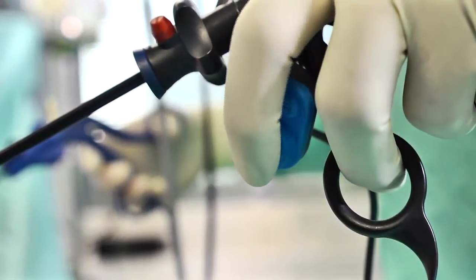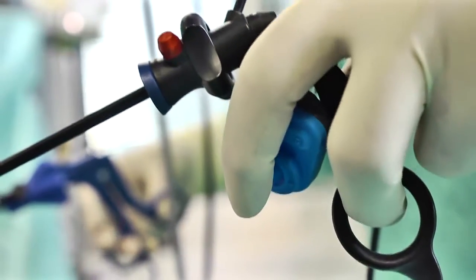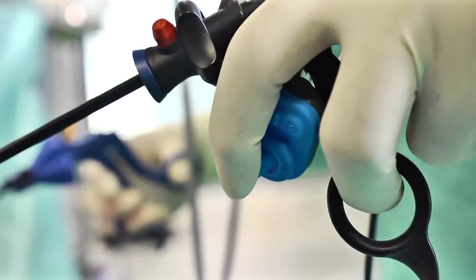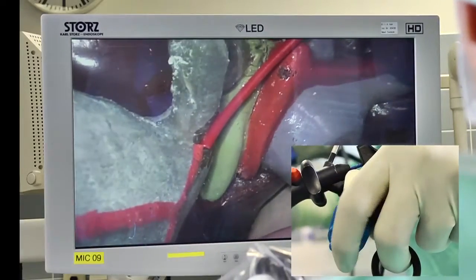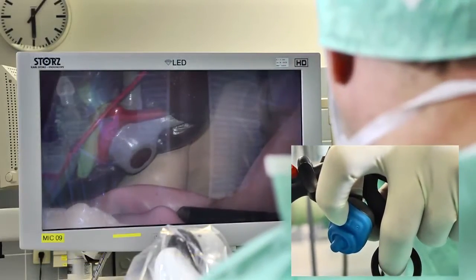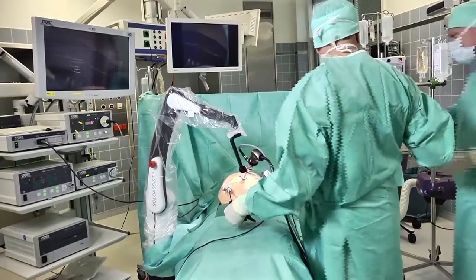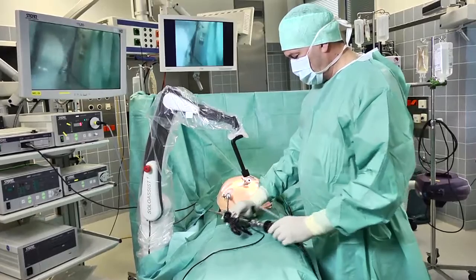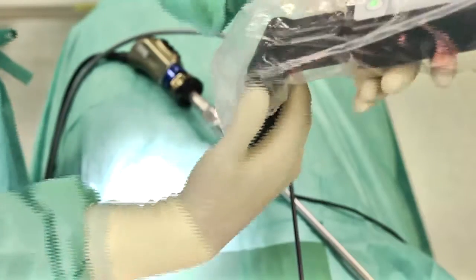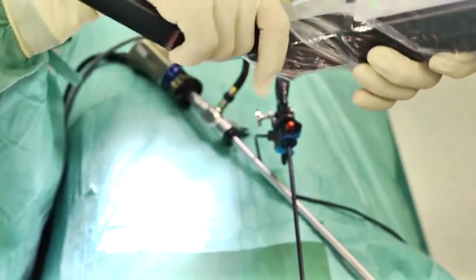You control the Solo Assist — and thus the position of the endoscope — via a small joystick on your left-hand instrument. At the same time, the endoscope can be moved intuitively to the left or right, up or down. The screen section can be reduced or magnified. A simple hand movement is sufficient to change the position of the universal joint.